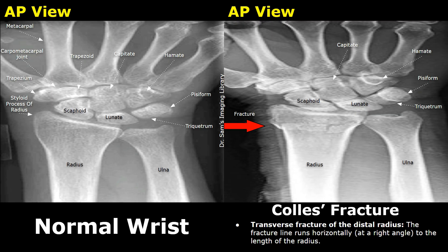Collis fracture is the fracture of the distal radius. It is usually caused by a fall on an outstretched hand. It is a common fracture in older adults with osteoporosis. We will look at x-ray images of Collis fracture and compare them with a normal wrist.